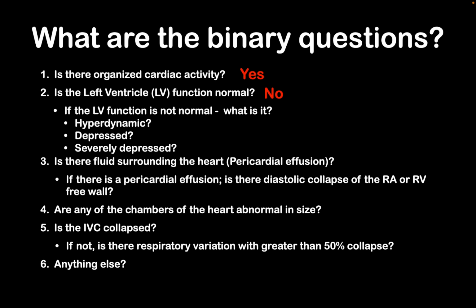And so which one is it? It is actually depressed in this case. I don't think this is severely depressed. This is just mild to moderate depression of the EF.